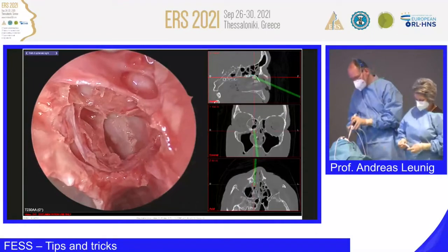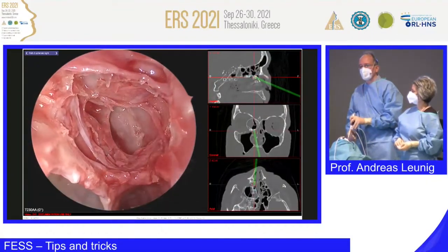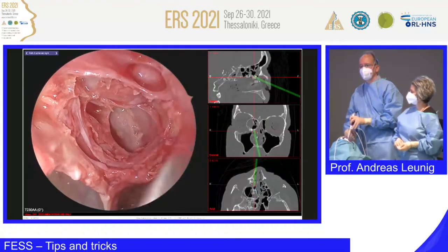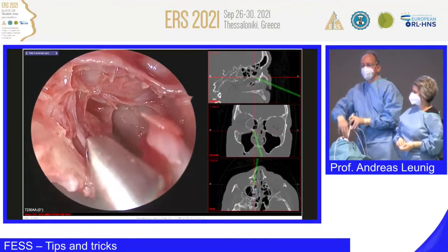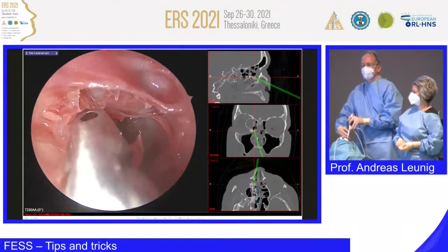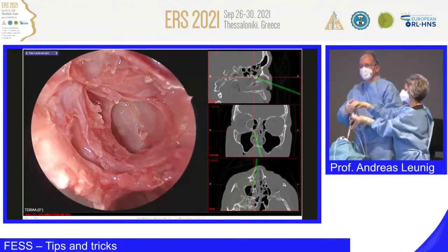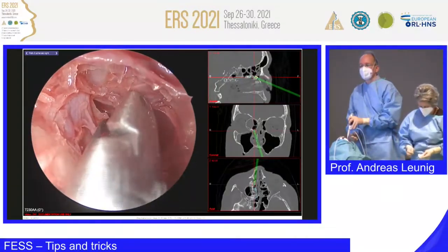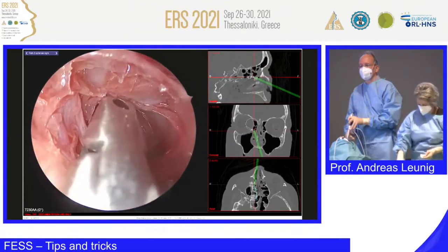I'm not sure where we are here and what structures we will see in a second. What would be for me personally a good landmark? Navigation is fine, but I don't trust it 100%. I want to always have control over my dissection. So I'm looking for the superior turbinate and I'm not sure if I can see it. Can you see the superior turbinate? Sean, can you see it? You're closer than I am.